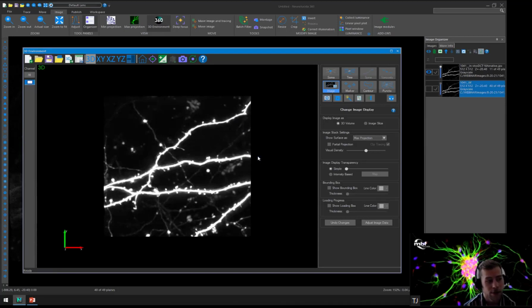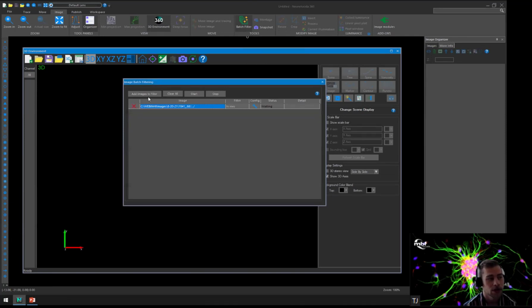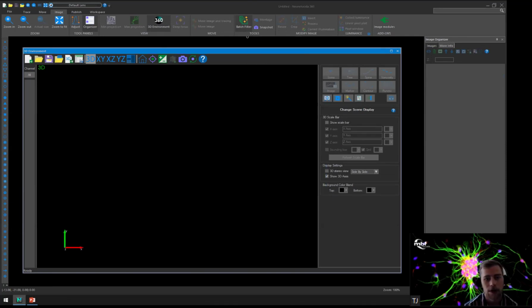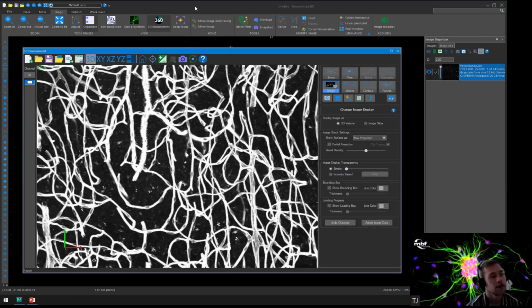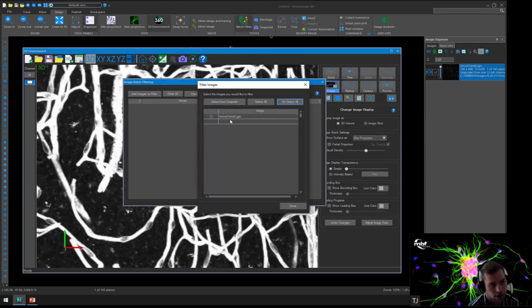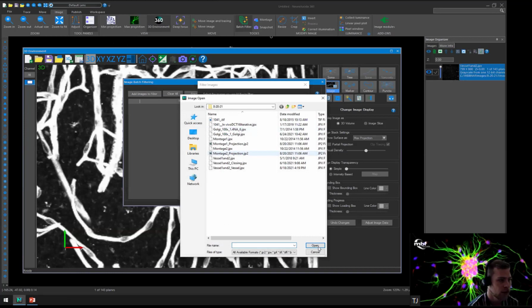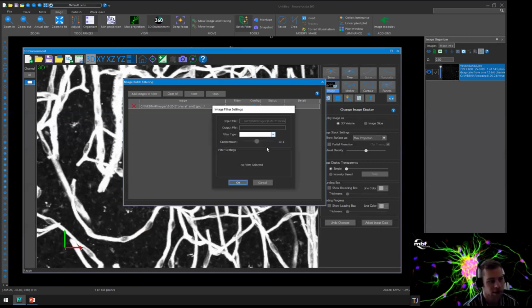The next image filter that I'll start to look at with you is the Morphologic closing filter. Here, I'm just going to bring in our in-house image data to start. And when we go to the batch filter, I'll select it from the computer, vessel 1 and 2. All of these, by the way, have been done prior to the demonstration. So please forgive me if it looks like I'm cheating. I am, but it's just to make this more efficient for y'all.